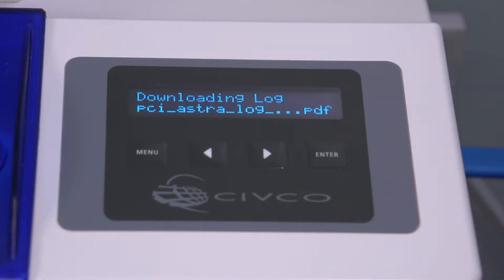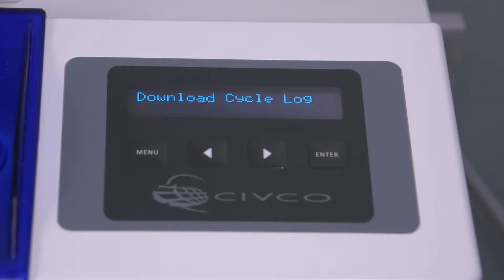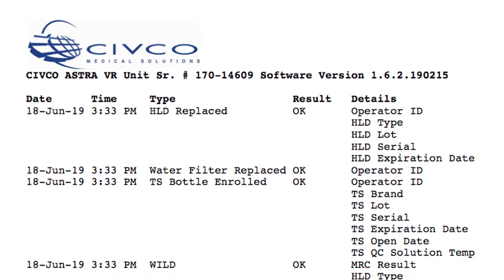The display shows 'downloading log,' and when finished it says 'log downloaded.' Then it goes back to 'download cycle log.' Press the menu button to go back to the main screen. You can now print the log on your computer.